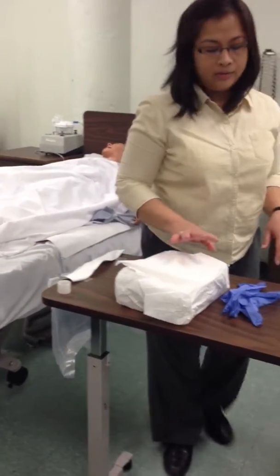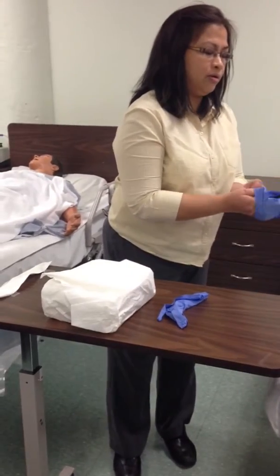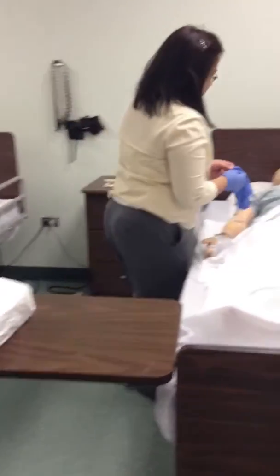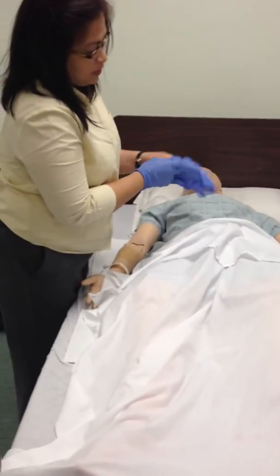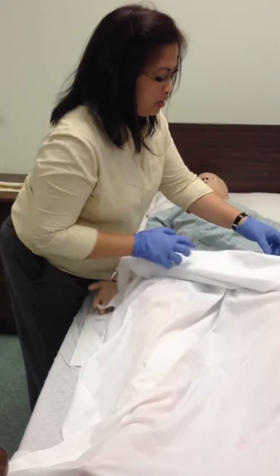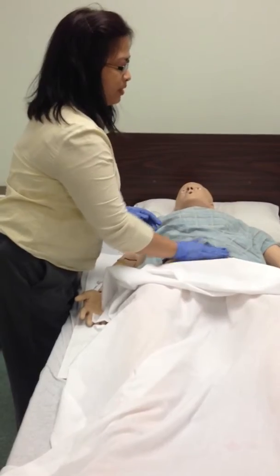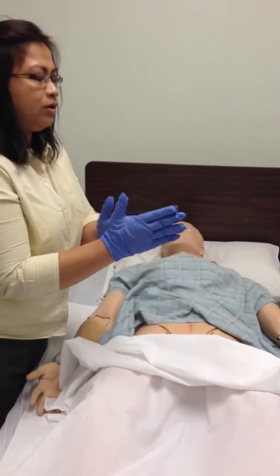So, like that. All right, you're gonna wear your clean gloves, okay? And you're gonna go over here and talk to the patient. Miss Mayor, are you okay? All right. I'm gonna open your gown and the linen. Okay. You verbalize to the teacher. You're gonna check for bladder distension. So you go like this. All right? And don't go like this. This is wrong. You go like this. You feel it with your palm.